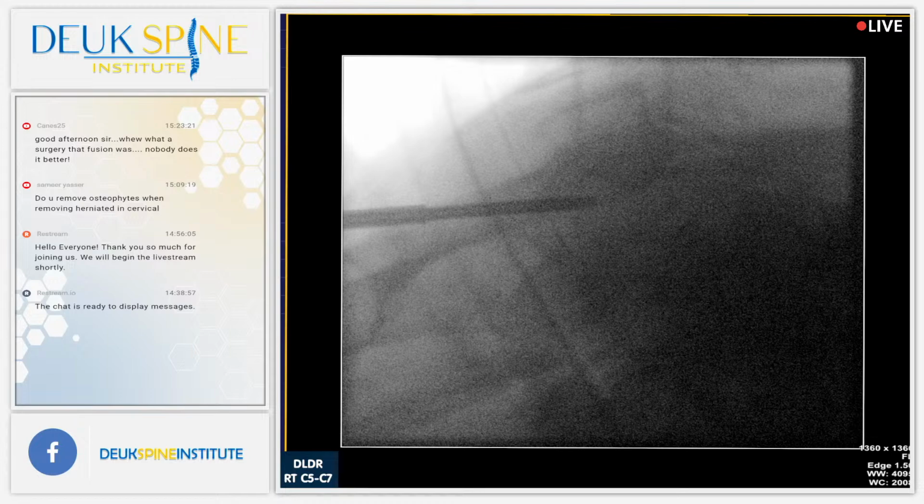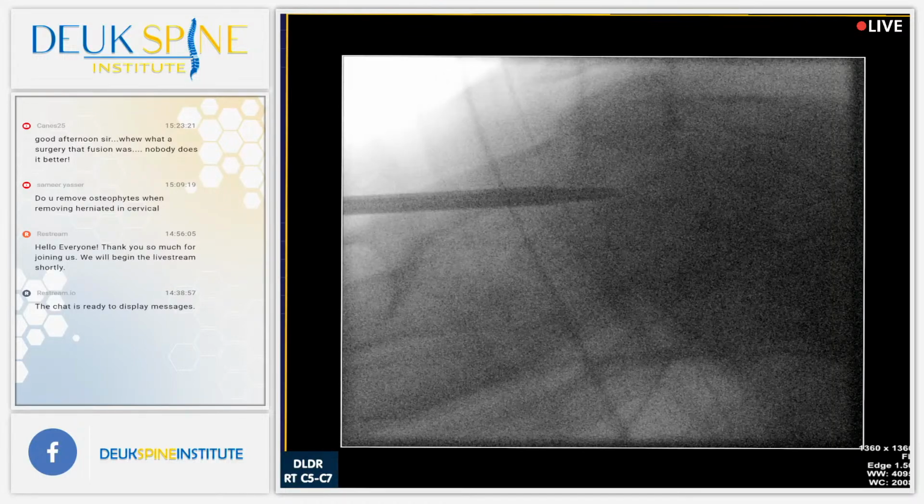Luis, will you hold this dilator right there with two fingers? Hold it, yeah. There we go. Let me try to bring the tube down. Shot. Almost there, actually. Yeah, we're pretty much there. Hold on. Let's try that, the whole unit together. Might be able to get it in there. Give me some inline traction. Yep. Shot.